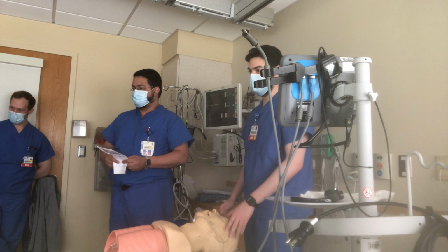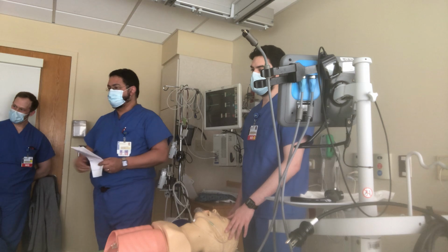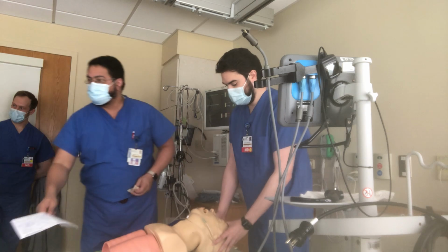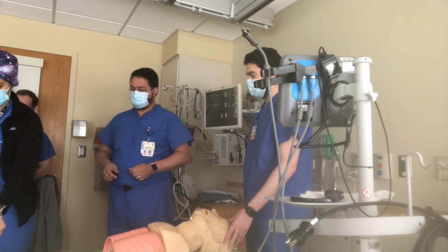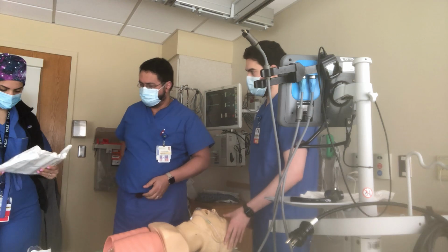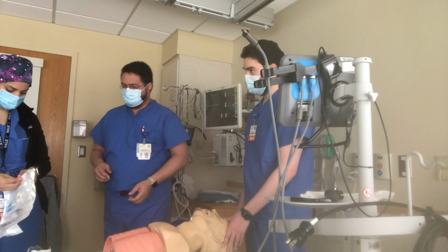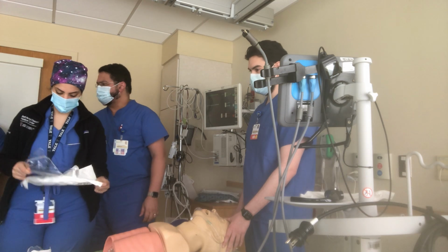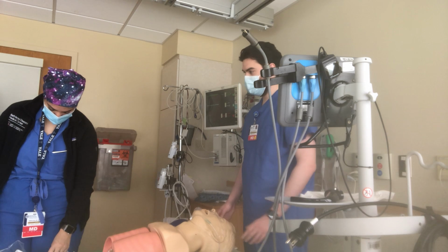It's in the bottom drawer. It's a little cylinder. Is it still in there? Oh, it's still there. Yeah. So Professor, take this. All right. Heart rate 132. All right. Open it. Can we get a box, any box of anything, to puncture, just to get the feel? Here, you do this. I got it.